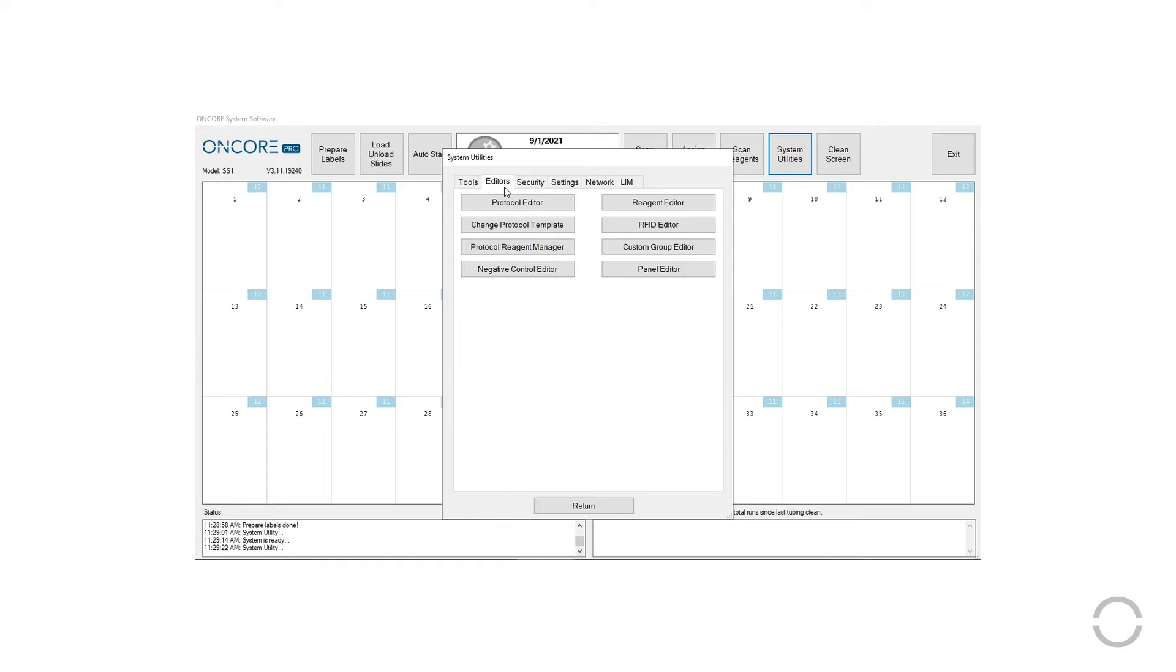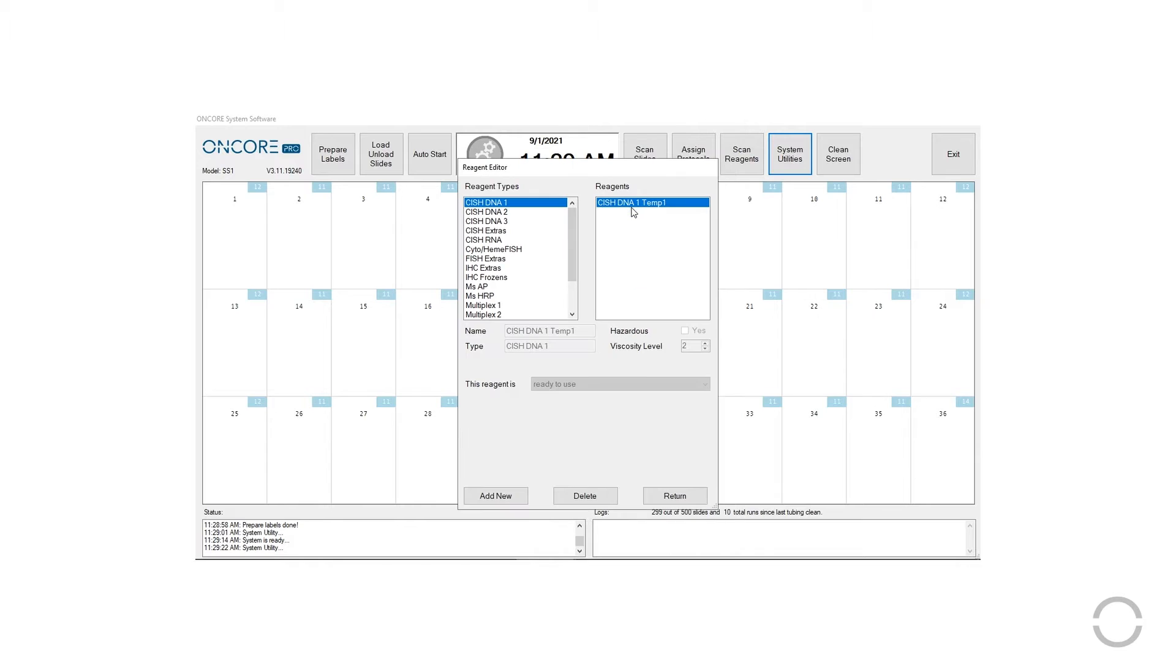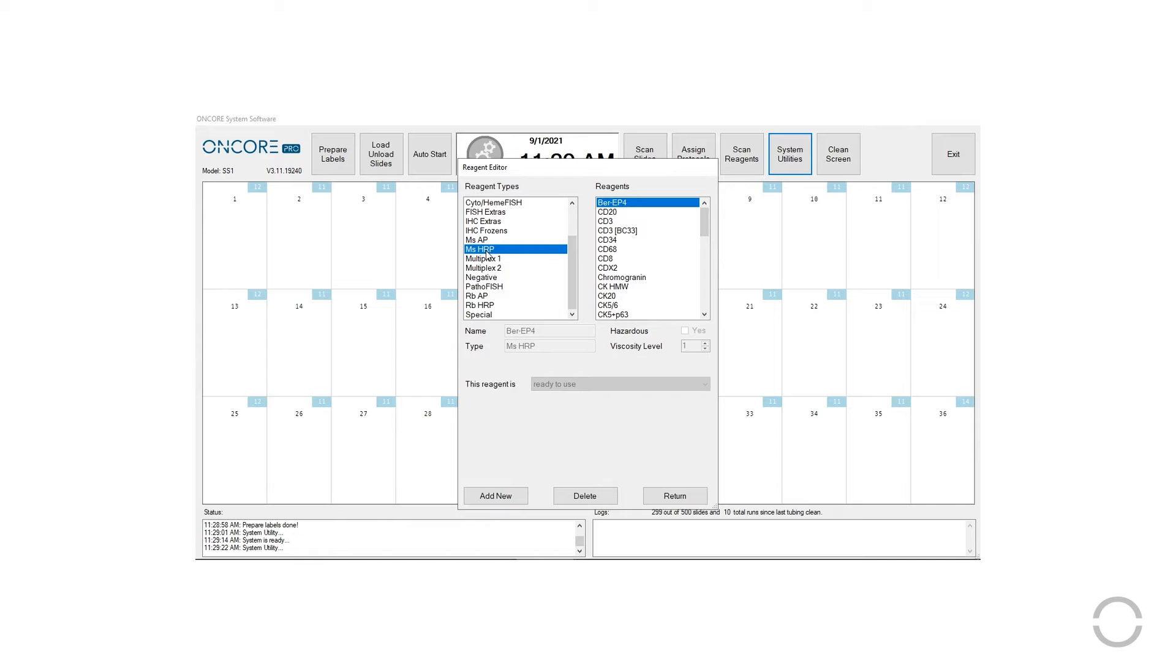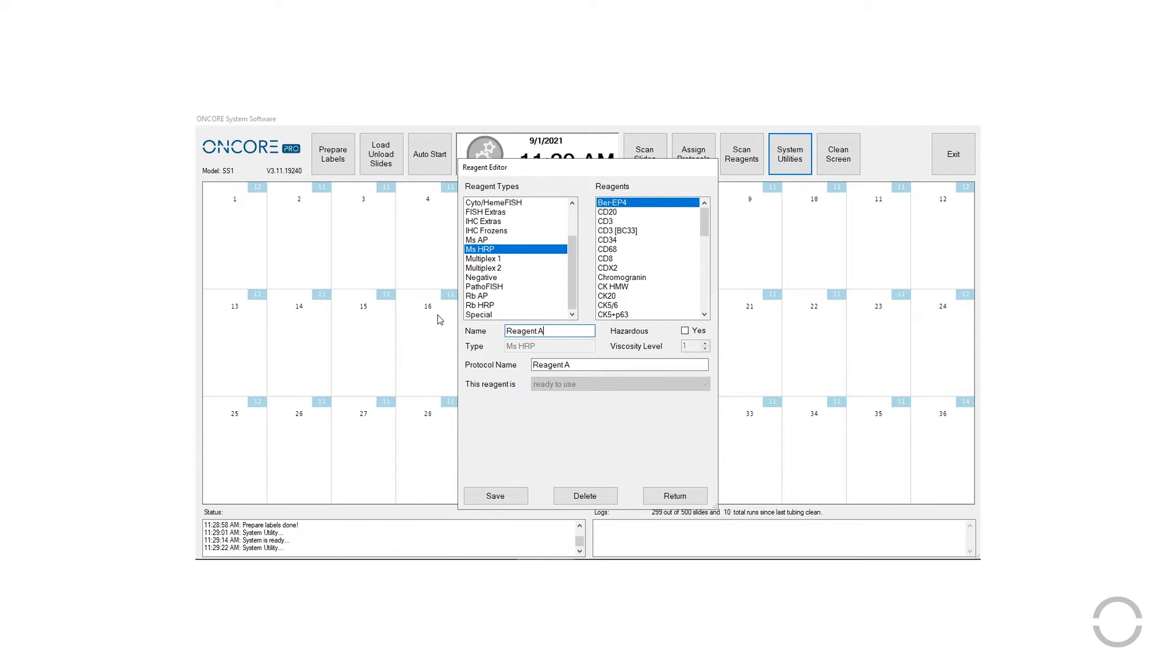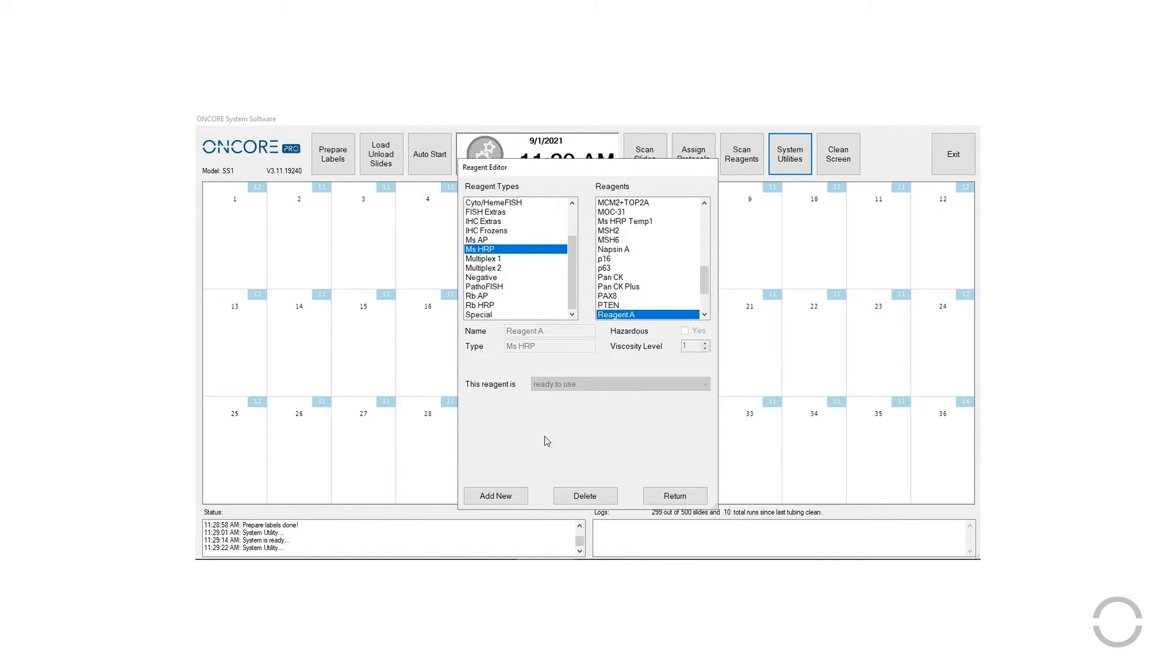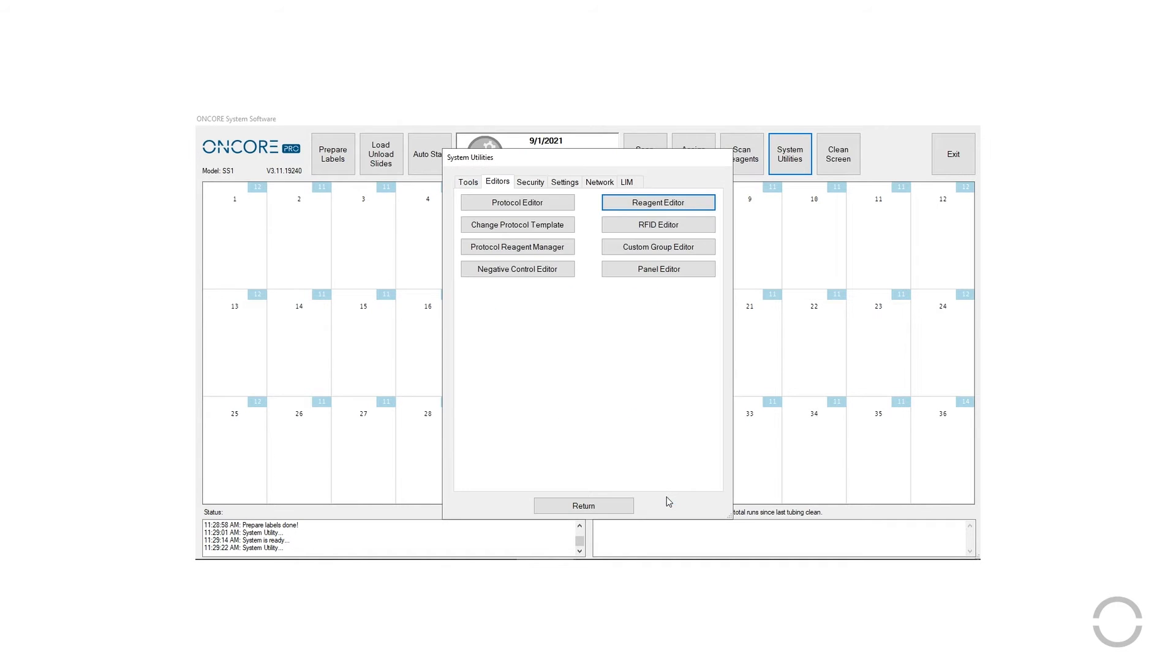Under the appropriate protocol template, if needed, refer to the instructional video on how to add a reagent. Once your desired reagent is in the reagent manager, you can customize its associated protocol by going to System Utilities, Editors, and Protocol Editor.